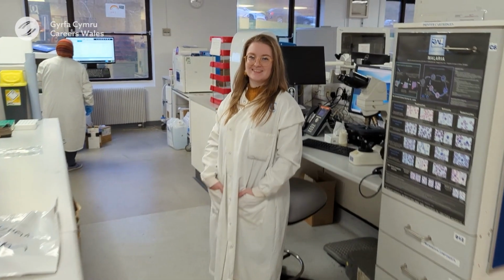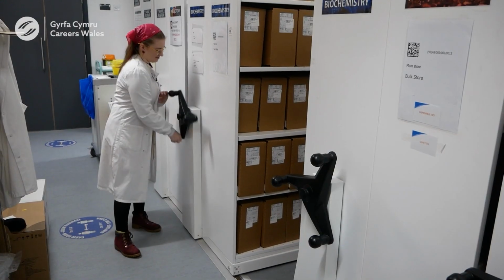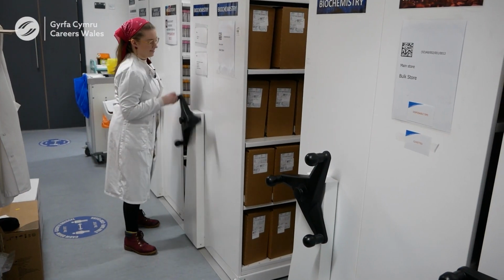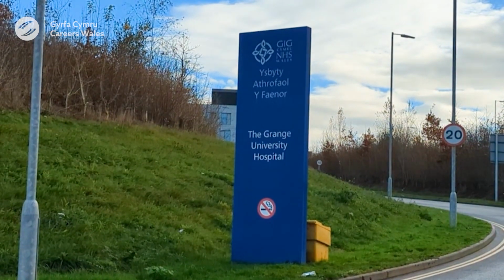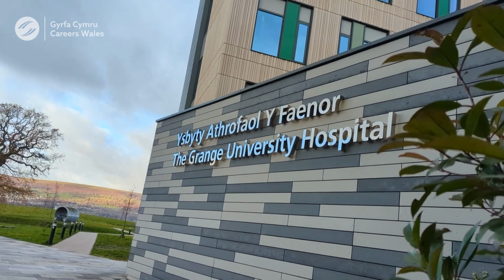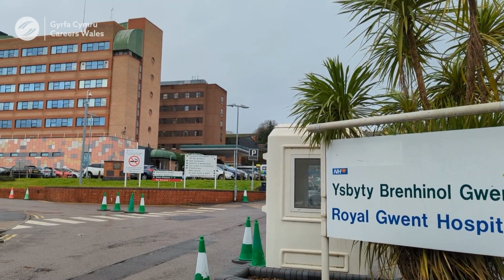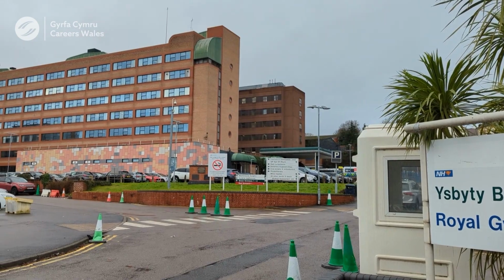My name's Harriet. I'm an Associate Practitioner for Biochemistry. My job involves assisting the biomedical scientists when they're trying to analyse bloods and produce results for the doctors to decide treatment. In this video today, we will be looking at how science and tech is used as part of my role. I usually work in 2 pathology laboratories within Aneurin Bevan University Health Board area.